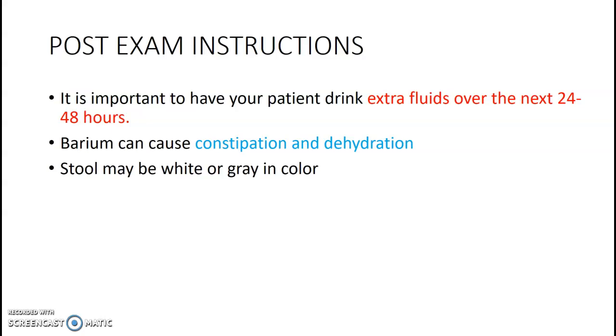Small bowel follow-throughs. I really would love for you to not ever tell your patient, oh, you're probably going to be done the next picture we take, because if you are not done the next picture you take, they are going to be really upset. So watch what you're saying. Don't ever give an estimate of pictures or time, because when it goes past that picture or past that time that you told them, they tend to get upset and they can't eat this entire time. So be aware. Watch your timing on the cards, make sure it's accurate.